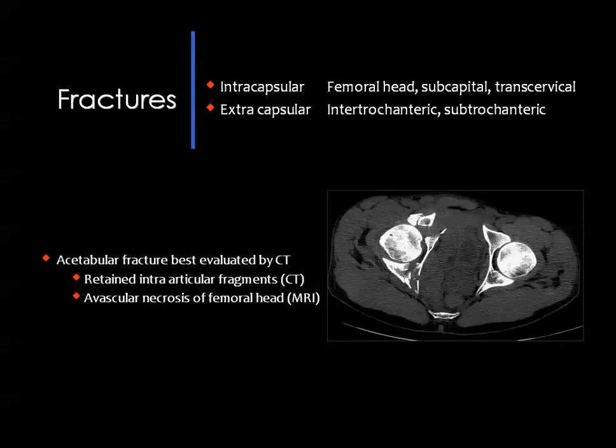considering the fractures around the hip, one important issue is that the femoral neck is intra-articular, and any fractures around the femoral neck will be intra-articular as well, or intracapsular. This is important information for the surgeon. He needs to know whether there are bone fragments inside the capsule or not.